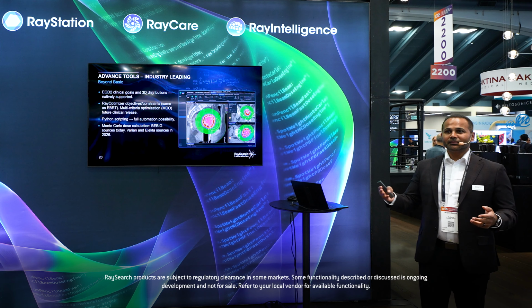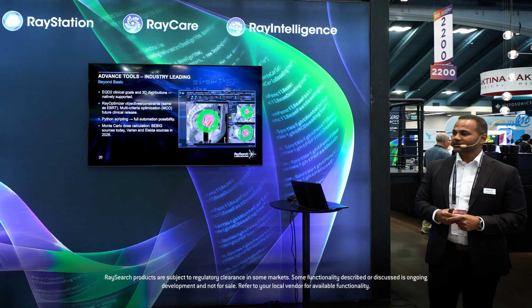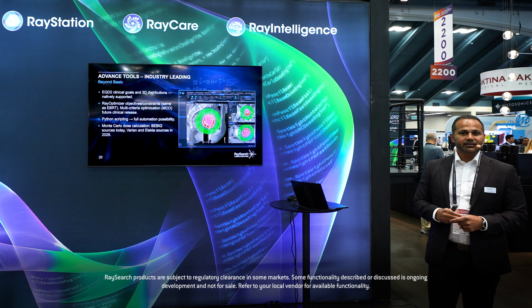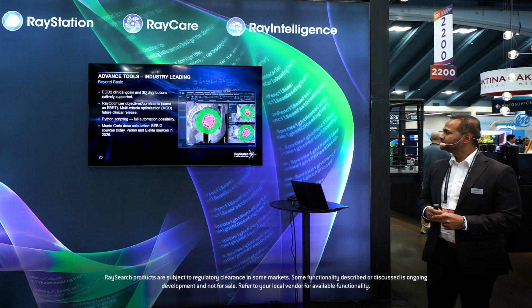Python scripting, to fully automate your workflow for Brachy, is something that is very unique to RayStation. And then we have Monte Carlo dose calculations for BEBIG at the moment, but coming in 2026, that will be available for Varian and Elekta afterloaders as well.